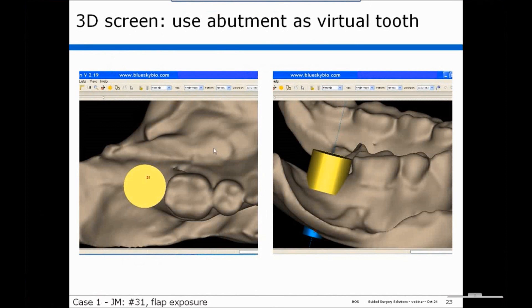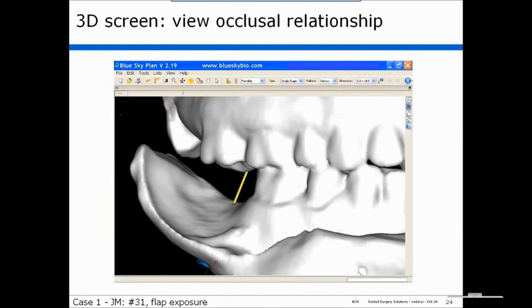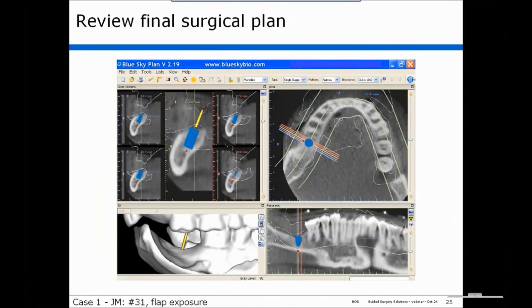You can also use the abutment as a virtual tooth to see quite accurately the relationship between the future tooth and the adjacent tooth. You can look at the occlusal relationship and see exactly where the center line of the implant will meet the upper molar. As a final quality control test, you can look at all the views to make sure everything is okay, and then this plan can be submitted for fabrication of a drill guide.